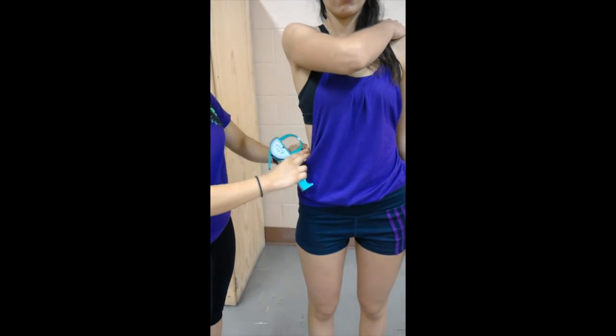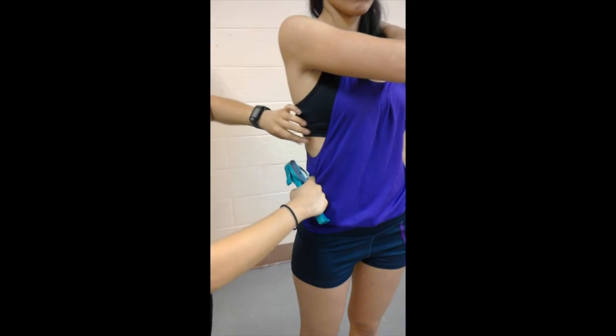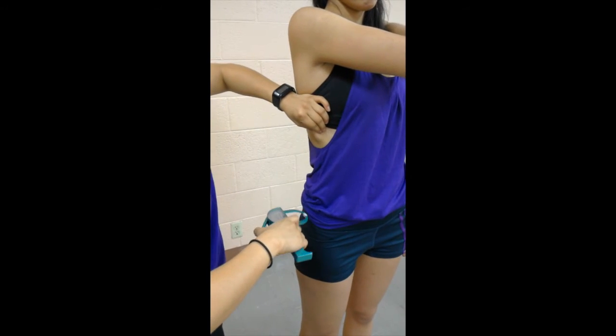The midaxillary site will be measured on the midaxillary line at the level of the xiphoid process of the sternum. This measurement will be taken at a vertical fold.